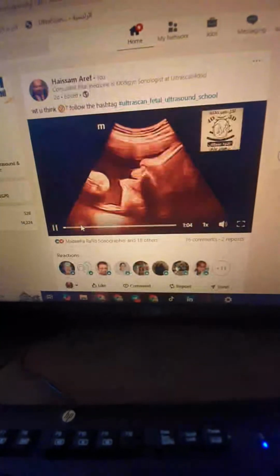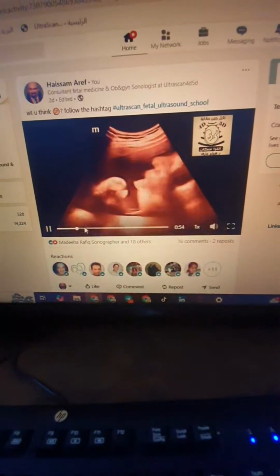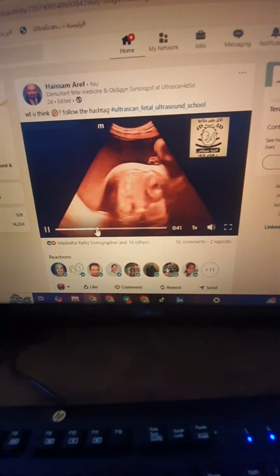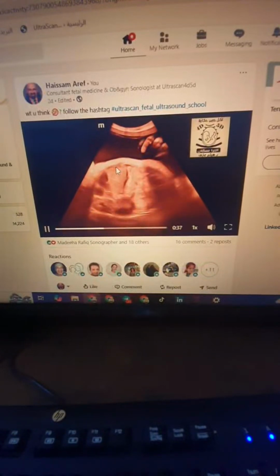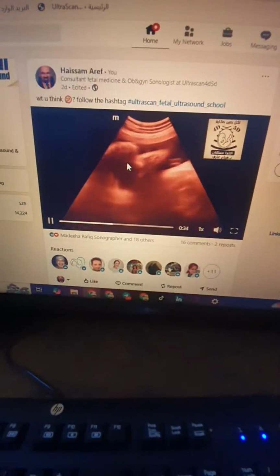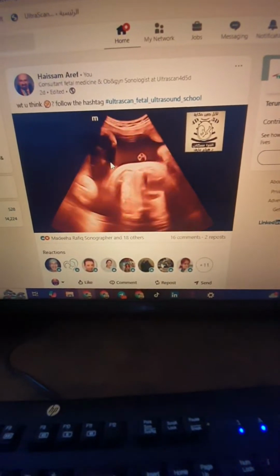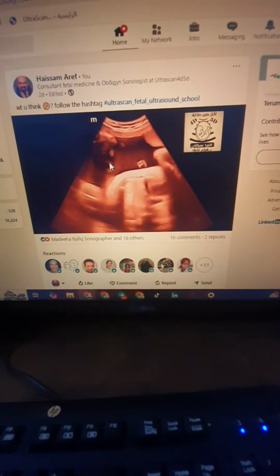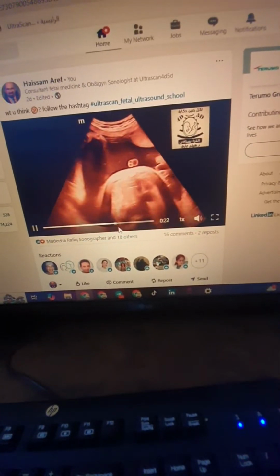And also, if you continue the lovely video, you will notice something very important after the macroglossia, like we have seen. After the macroglossia, there is a diaphragmatic hernia and there is a small omphalocele apparent at the insertion of the umbilical cord.